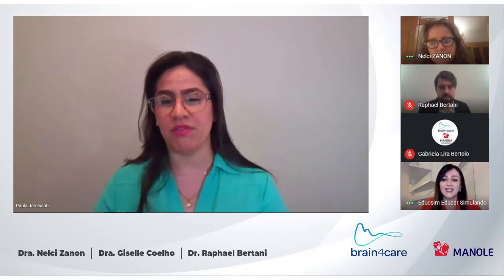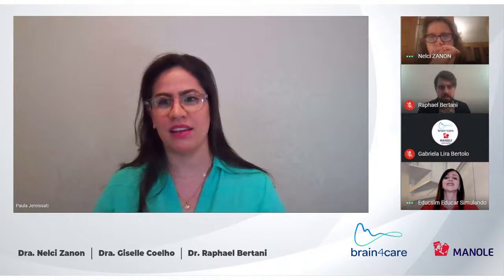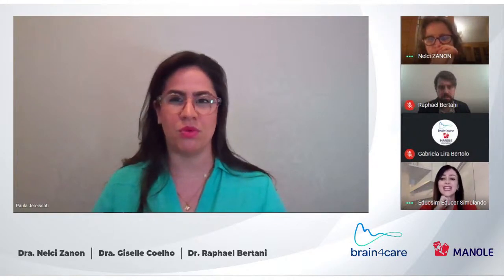Great. So Dr. Giselle, you were able to adjust her shunt or her valve with the waveform. So you kept looking at the waveform and were able to say, here, this is the good pressure. I'm satisfied with that. And perhaps she won't have any more pain or headaches or anything. Exactly. Great. Exactly. Definitely quality of life.